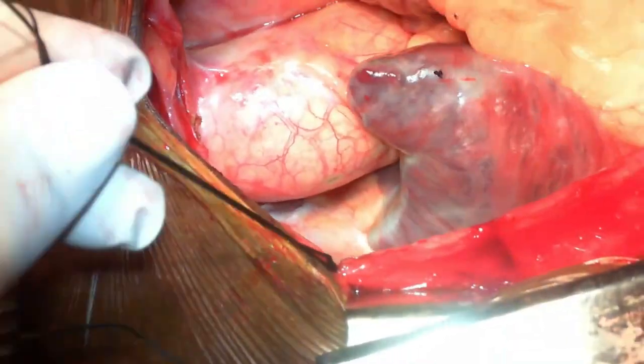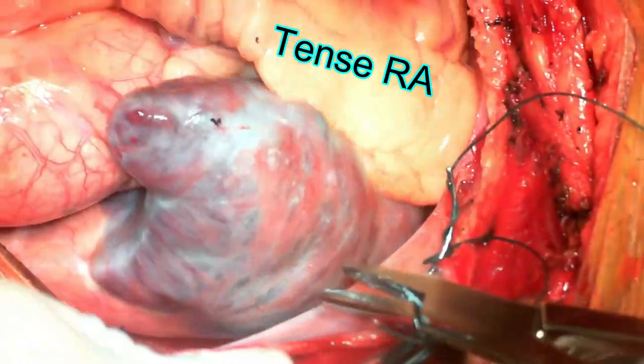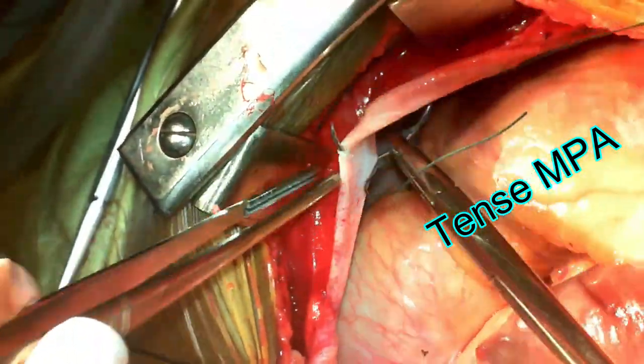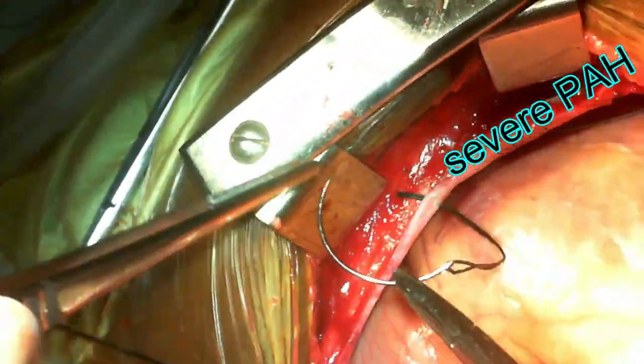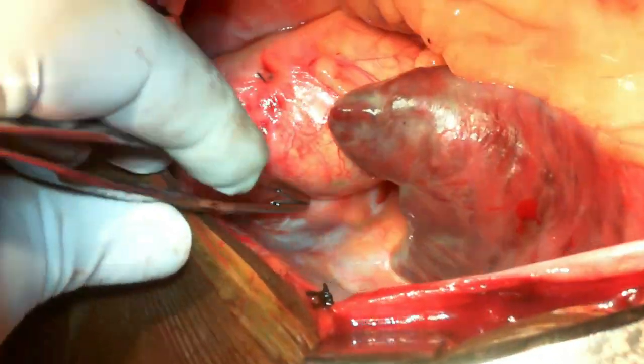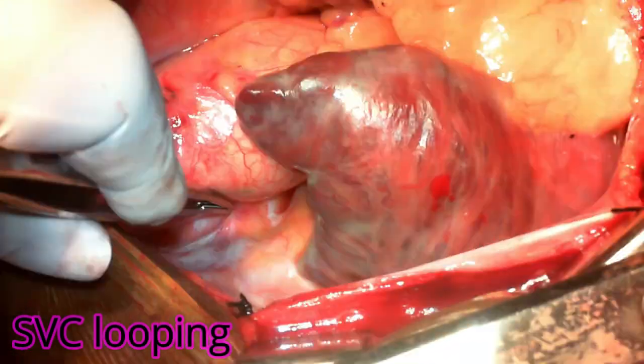The first part of the demonstration will be a bicaval cannulation for a patient with severe mitral stenosis, severe tricuspid regurgitation, and severe pulmonary artery hypertension. As you can see, both the right atrium and main pulmonary artery are very tense. The first part of venous cannulation always starts after you take the purse strings for the aortic cannulation site.